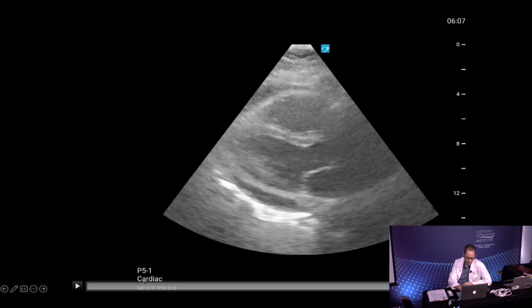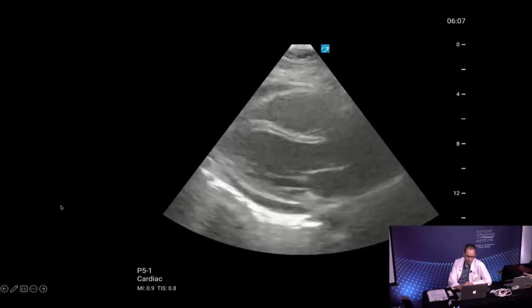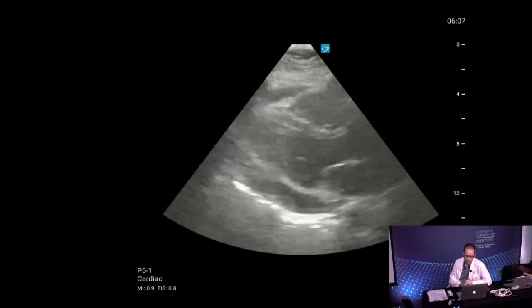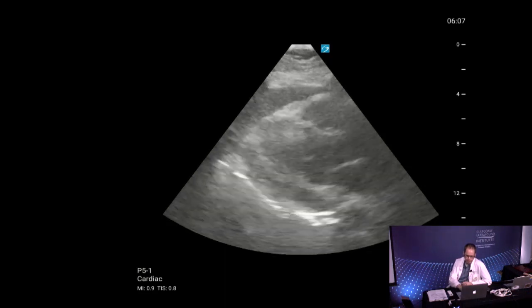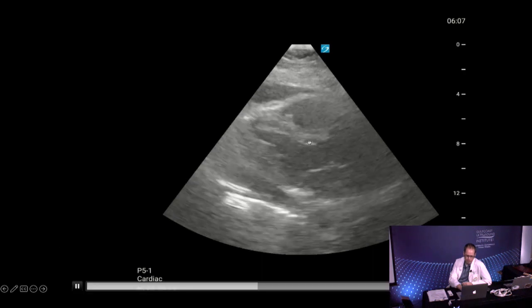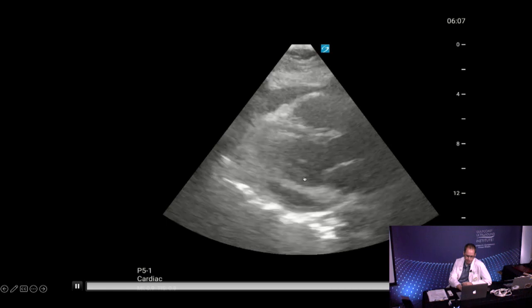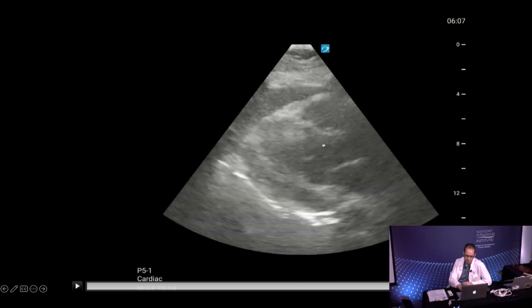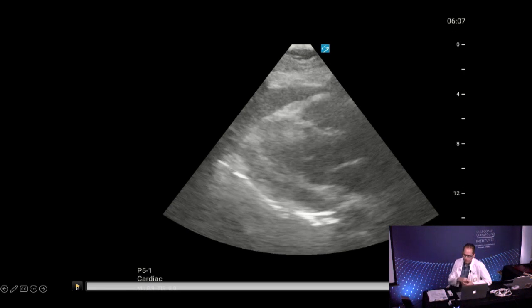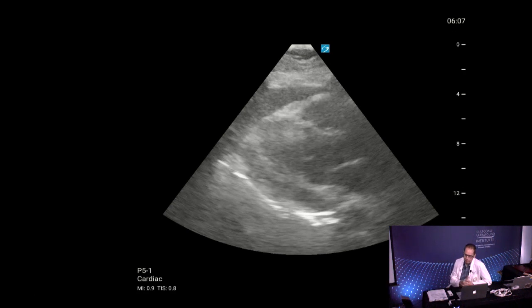And then this is the result. So you can see how much larger that heart is now. We can see clearly that there's no right ventricular collapse when the heart is in diastole. As the mitral valve leaflet comes up and hits the septum, there's no collapse there. She still has a large effusion. We left a pericardial drain in place, and over the next few days, cardiology came to the ICU and would take off 100 or 200 cc's as needed.